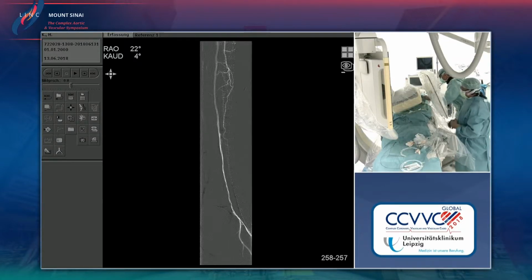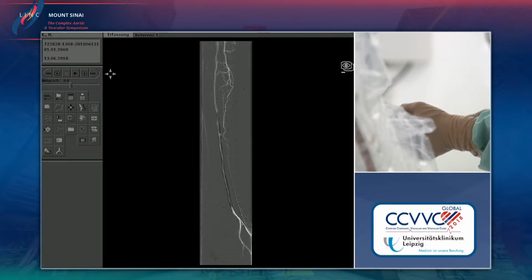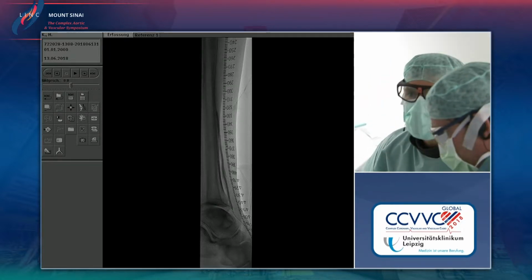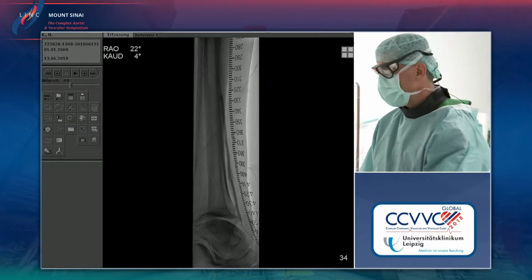Andre, you mentioned that the patient already had pain when you did the ballooning. Can you tell us about your experience when you inject the needle into the vessel wall? Do the patients also feel pain? Well, good question. Usually not. We had one patient who felt some pain, but other patients didn't feel it.